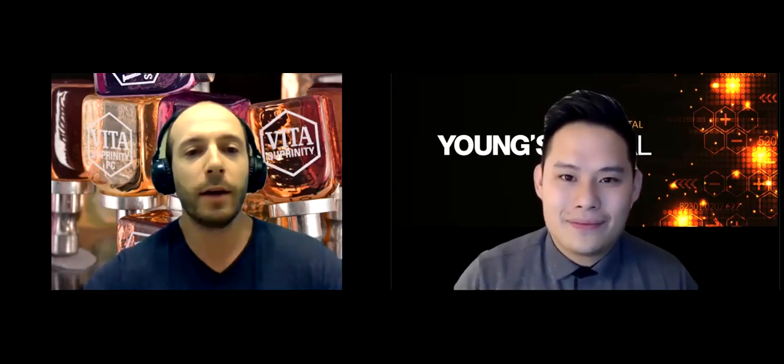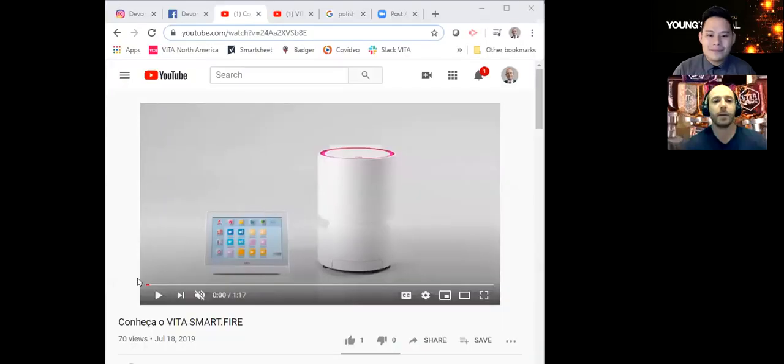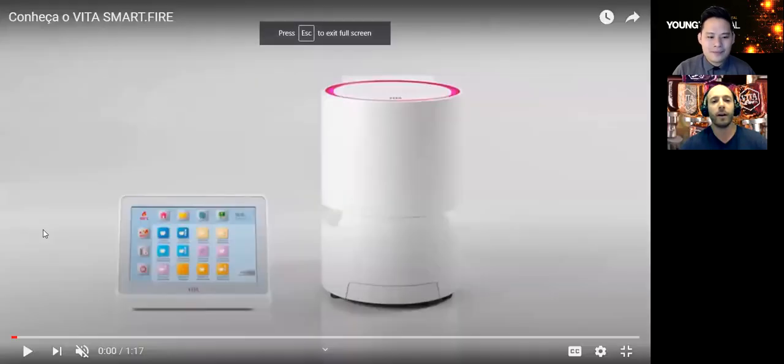Yeah, absolutely. I'm going to share my screen here and I got a YouTube video queued up. So this is our SmartFire oven. It's going to crystallize and stain and glaze any of your CAD-CAM materials. It can't sinter zirconia, but it can glaze zirconia. What I really like about this furnace is that in Southern California, a lot of the CAD-CAM offices are limited on space, so we don't have a ton of room for these large porcelain furnaces.